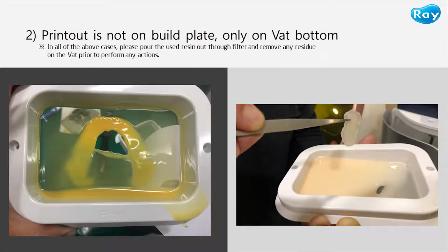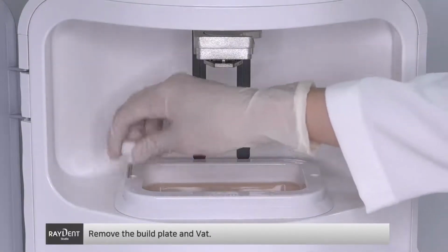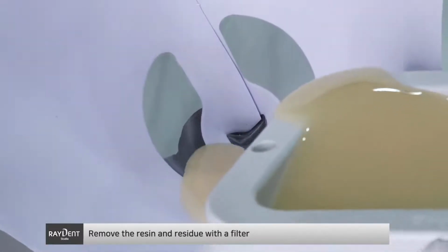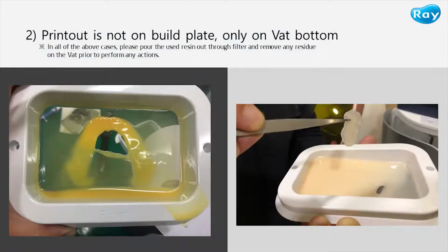Number 2. When the printout is not on the build plate and is attached to the bottom of the VAT, first of all, in all cases, remove the build plate and the VAT from the printer and pour the used resin out through a filter prior to performing any actions. Now, as you can see in the chart, let's take a look at the causes and the actions that should be taken when the print is off the build plate and attached to the bottom of the VAT.